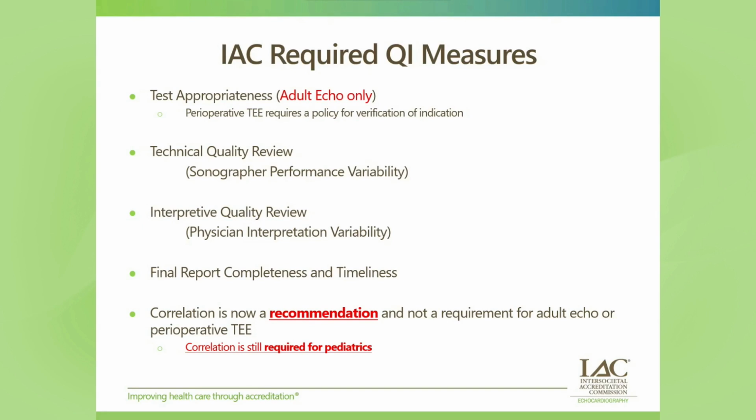Finally, IAC recommends routine correlation and confirmation of results with other imaging or diagnostic modalities in adult echo. However, this is still a requirement for pediatric echo lab accreditation. We'll get a little bit into correlation later.